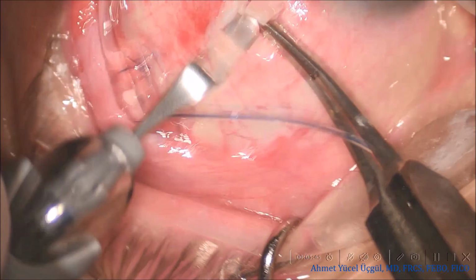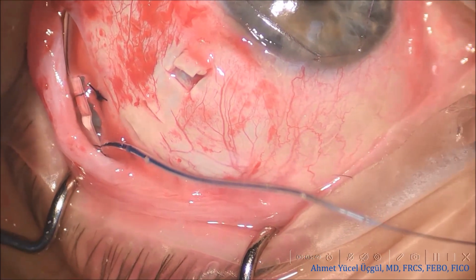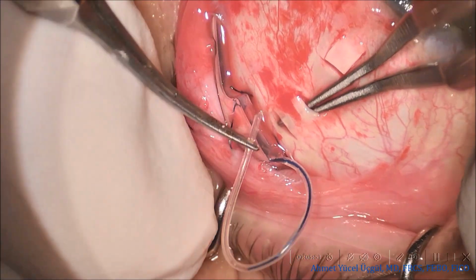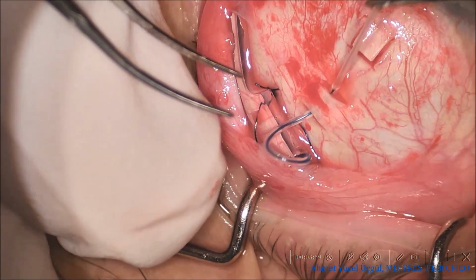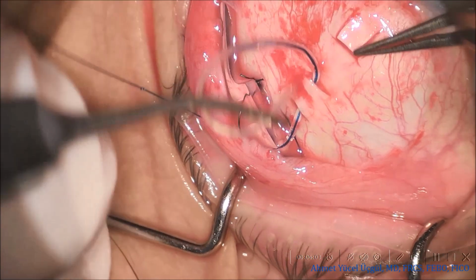Afterward, the thin tube is advanced beneath the scleral tunnels and brought into the flap area. The tube remains at approximately 80% scleral depth beneath the tunnels, and it is also maintained at the same 80% depth under the scleral flap. From this uniform plane, it is then directed into the anterior chamber in a course parallel to the iris.